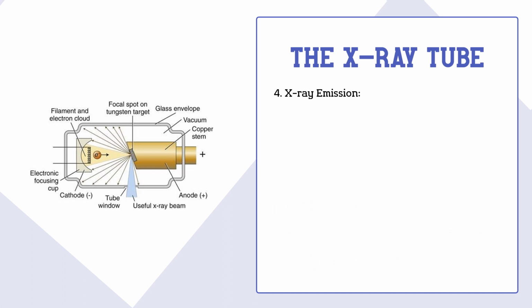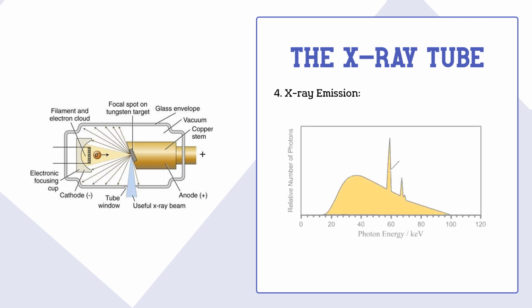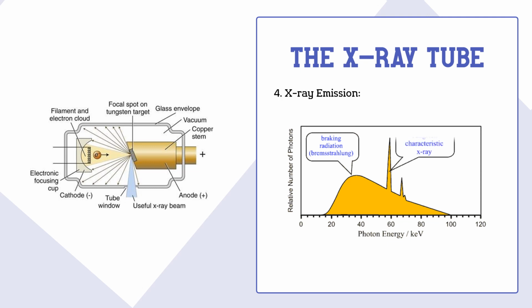Unlike Bremsstrahlung X-ray, the characteristic X-rays are emitted at discrete energies. So, the overall produced X-ray photons from the X-ray tube are in the form of a heterogeneous spectrum. This spectrum consists of the continuous Bremsstrahlung X-ray superimposed by the characteristic X-rays.